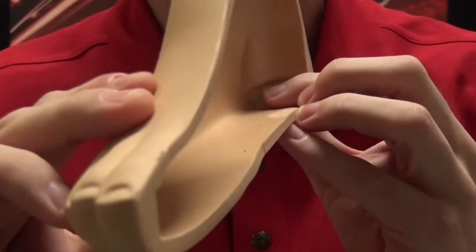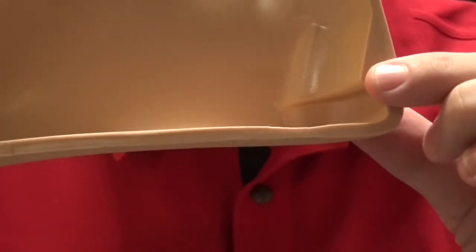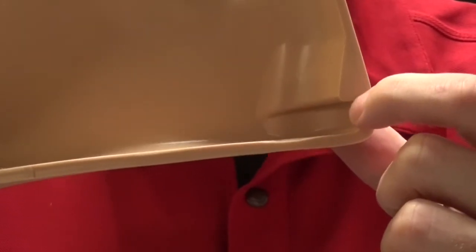So what I have here is a cut in half foot shell. What I'm using this to do is to illustrate that the lip that holds the foot in place is much thicker at the most posterior aspect, and it thins out. You see how that lip gets thinner as you move forward towards the ankles in an anterior direction? That's why it's easier to roll the foot into that area first than it is to just try and stretch that huge lip out and off the foot.